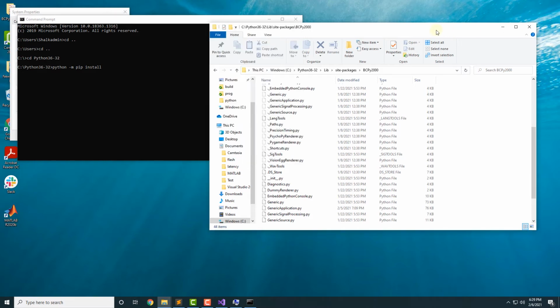Now that I've shown you how the Python portable package works and how to build your BCPy2000 modules, I'll go on to show a demonstration.